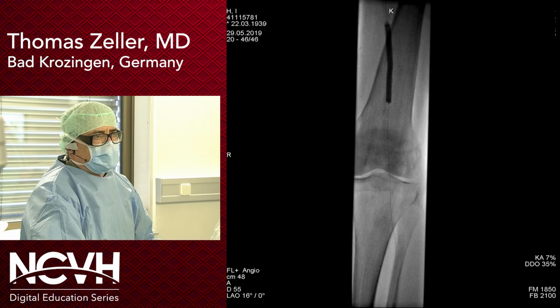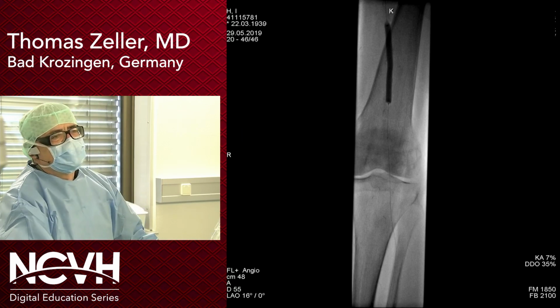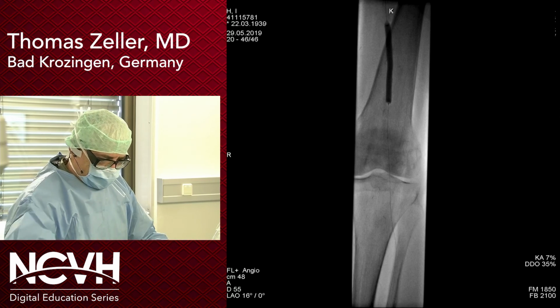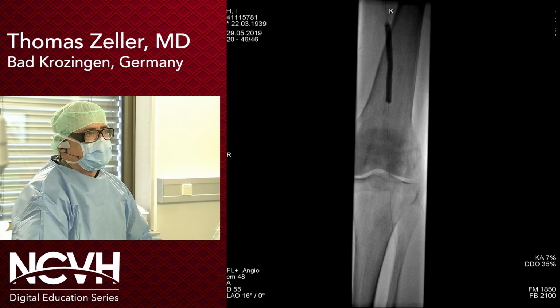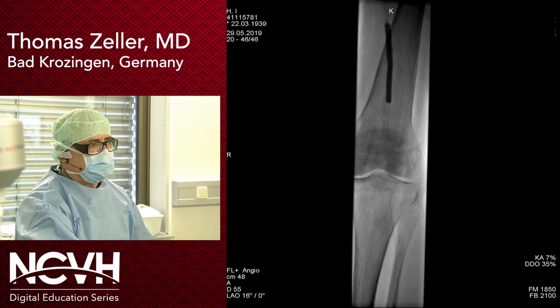Yeah, I don't know what else we could discuss, because I believe it's not so interesting to watch the balloon inflation for 3 minutes. Well, we could argue about the total dose of drug that is going to end up being delivered with the 2 DCBs in the supra-popliteal space, and then another long 2.5 by 30 centimeter balloon below the knee. So what are the thoughts on that?